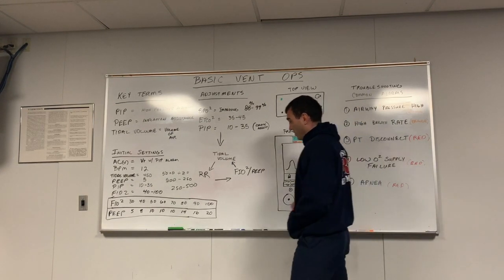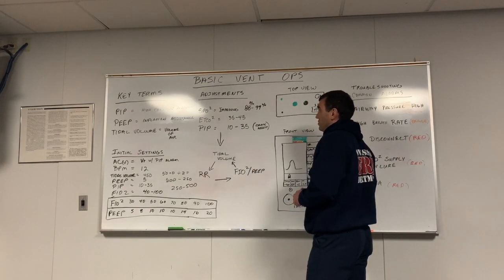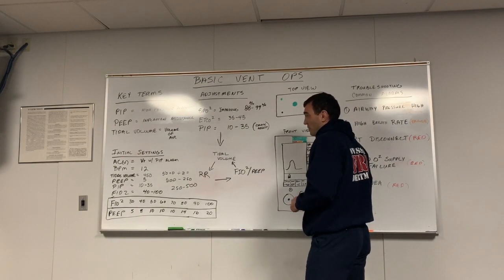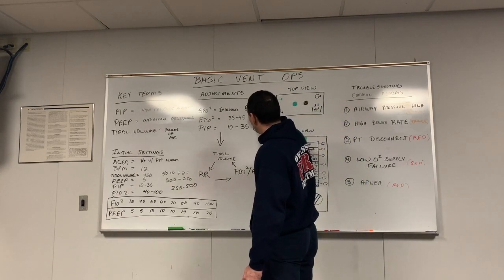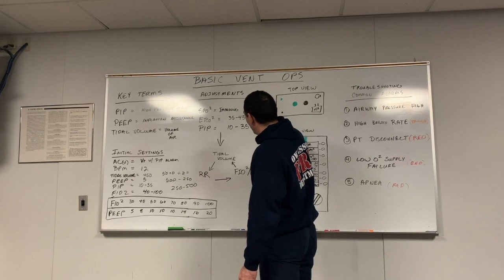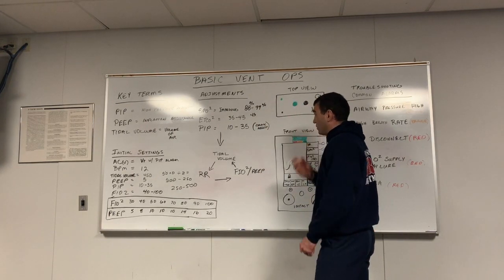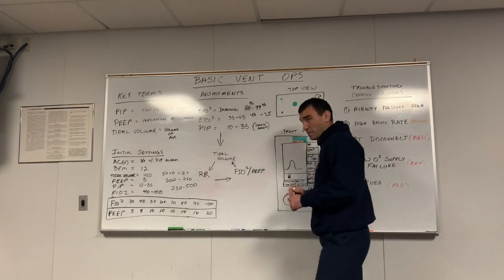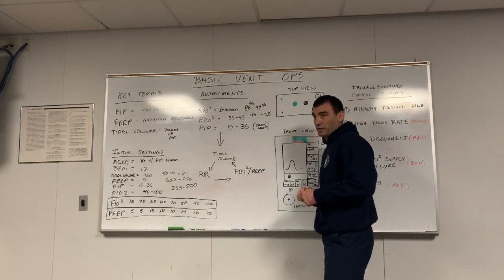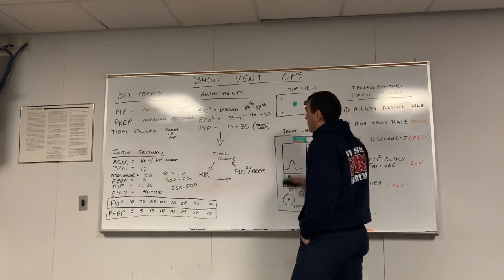Okay, and we can use this. Most importantly, what I use end-tidal CO2 on adjusting the vent is that if I put a setting on here and let's say my number was 45 when I first started, okay? And then I put the patient on the vent and I breathe for him for 10 minutes and now the number is 25, okay? We have a problem. I'm breathing way too fast, okay? So I can slow that and make that adjustment based on the end-tidal CO2.